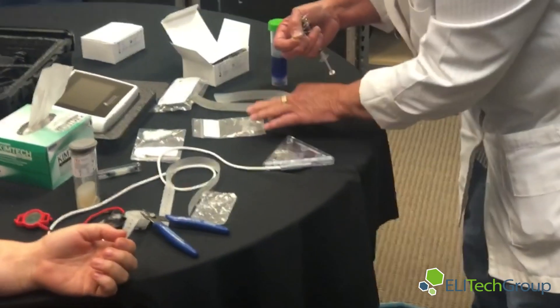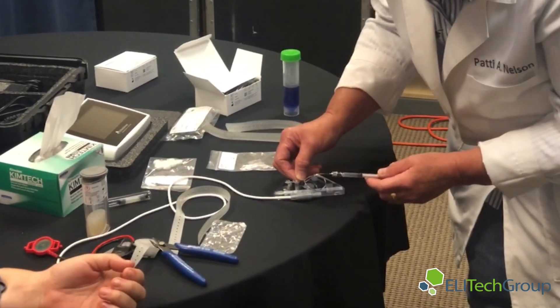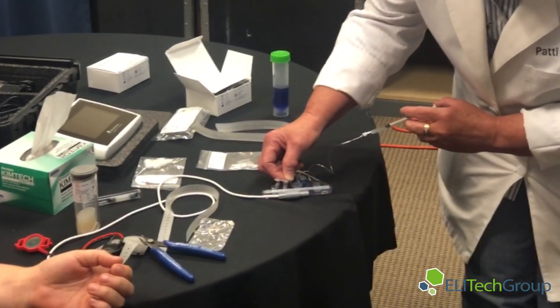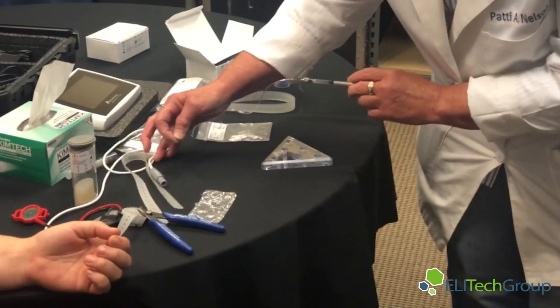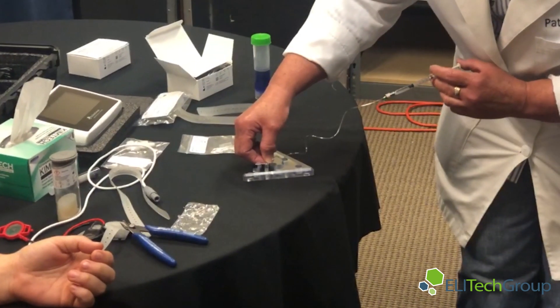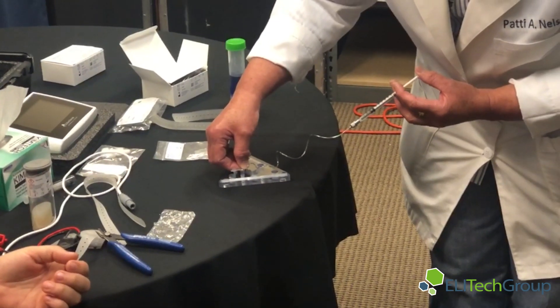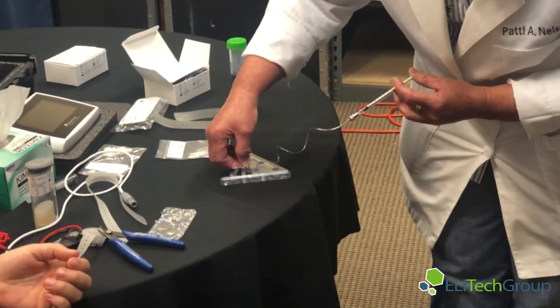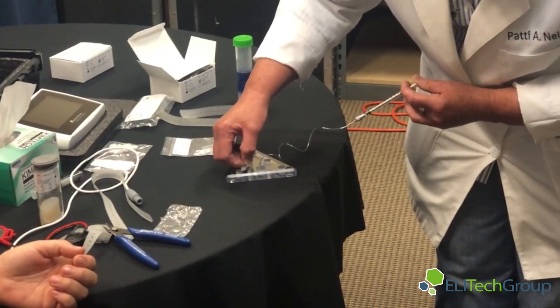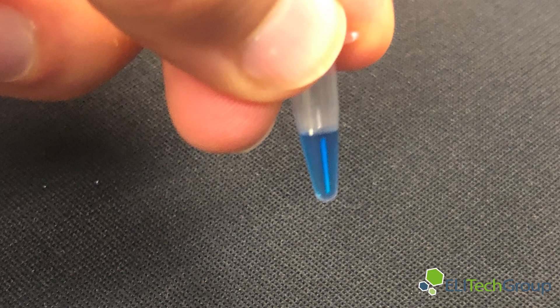We'll bring it over to our collection vessel, which is the macro-bore PCR tube available in the kit. Put the end of the micro-bore tubing into the PCR tube — you can see how the end kind of curls. As I push on the syringe, you can see the sweat being dispensed. The sweat has been dispensed, and you now have your sample here in your small PCR tube.